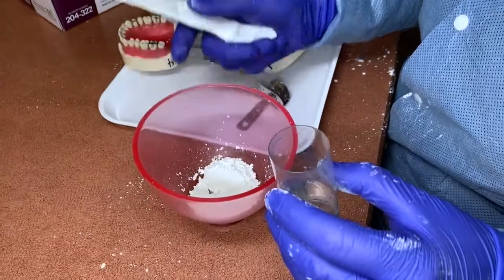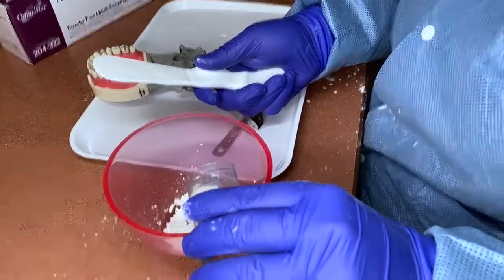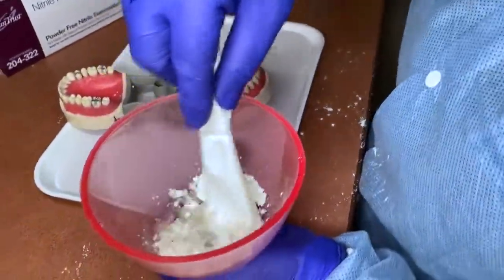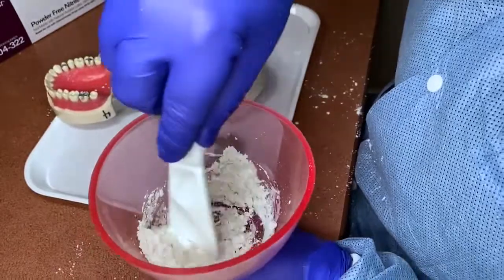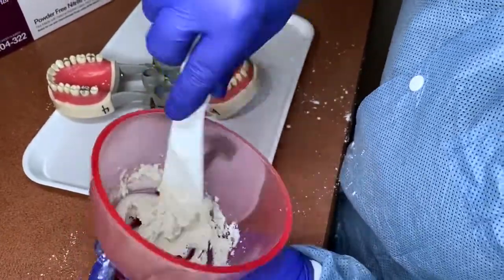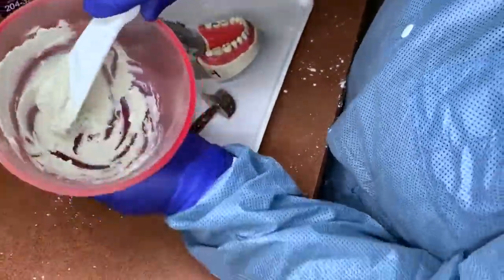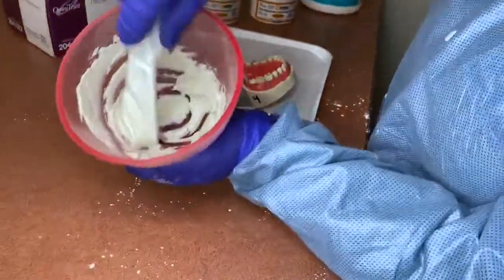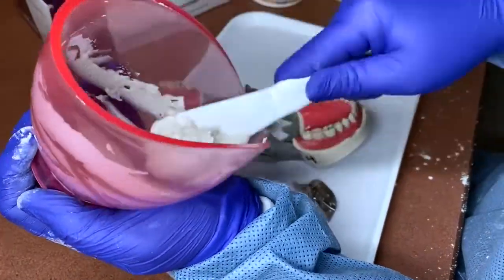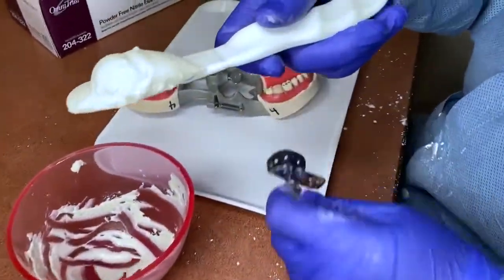There are two ways to mix alginate: you can have the water in the bowl first and add the powder, or have the powder in the bowl and add the water. Mix until it's a homogeneous, smooth mix with no bubbles. Start mixing upright so it doesn't splatter, then turn it sideways — these bowls are pliable for that purpose. Once it's smooth, scoop the sides, flip it, and scoop it up into your spatula to add to your tray.